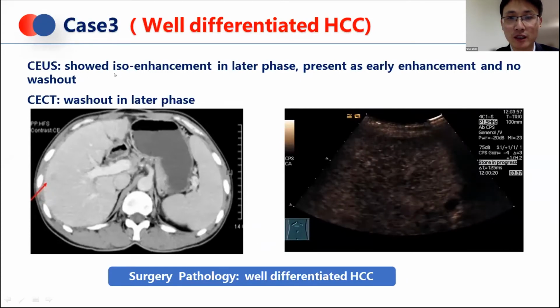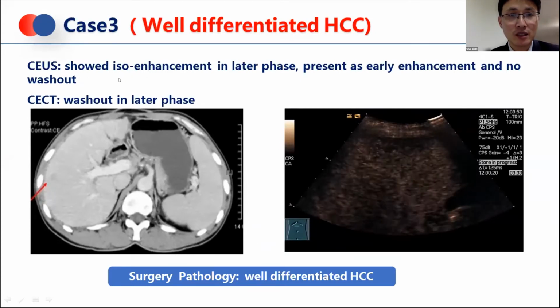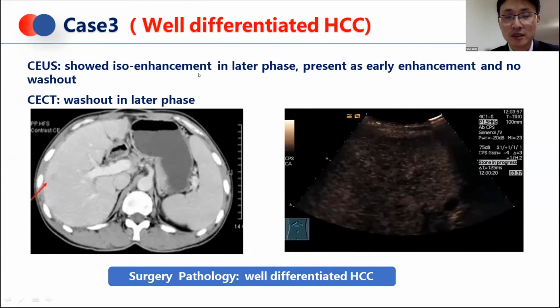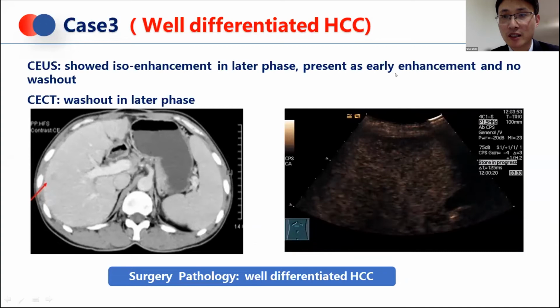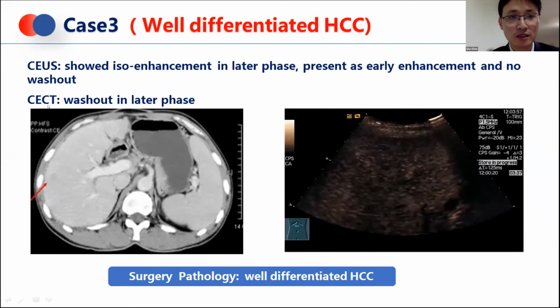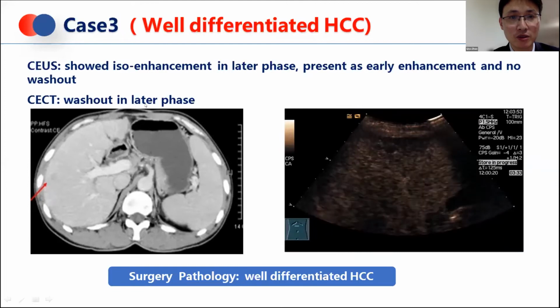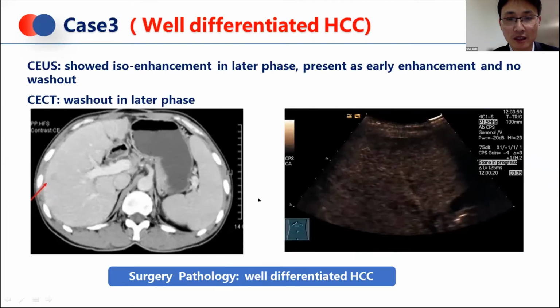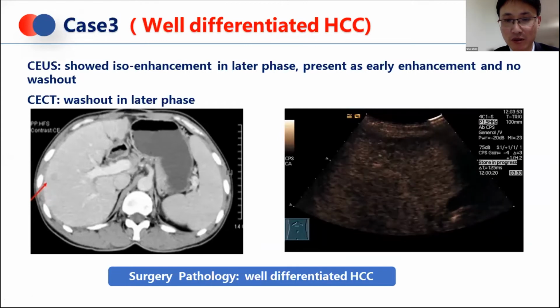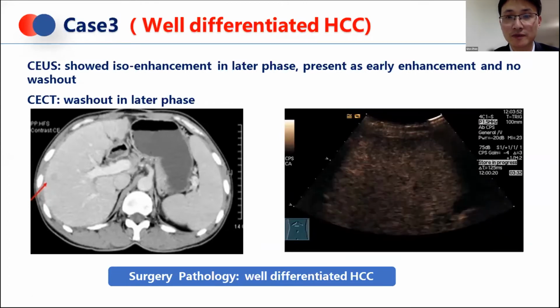We monitored until the late phase. This nodule shows iso-enhancement in the late phase, presenting early enhancement and no washout, while in contrast CT, it is washout in the late phase. After the surgery, the pathology confirmed it's a well-differentiated HCC.